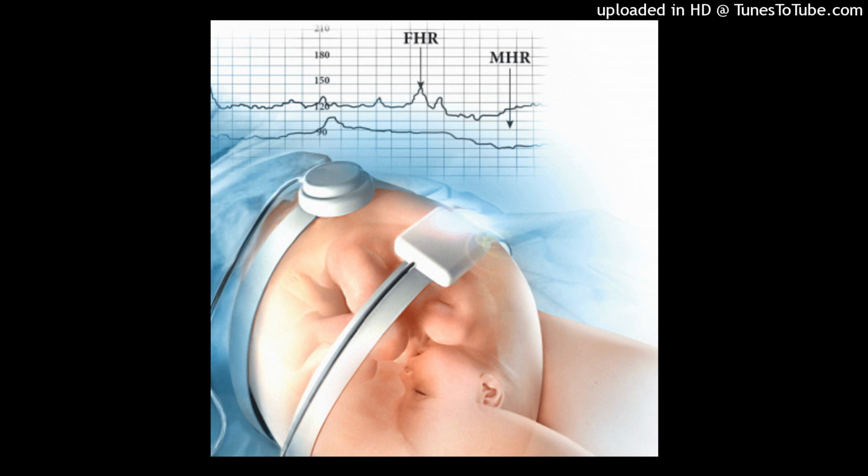The low-technology method of fetal surveillance requires a clinician to count the fetal heart rate, FHR, with a fetoscope or Doppler in relation to UA. Counting and palpation occur at specified intervals for a predetermined amount of time depending on the stage of labor and patient risk status. Palpation of the uterus by the clinician provides UA information such as frequency, duration, intensity, and resting tone. Unlike auscultation and palpation, EFM incorporates a complex electronic device that acquires, processes, and displays the FHR and UA with visual and computer interpretation.